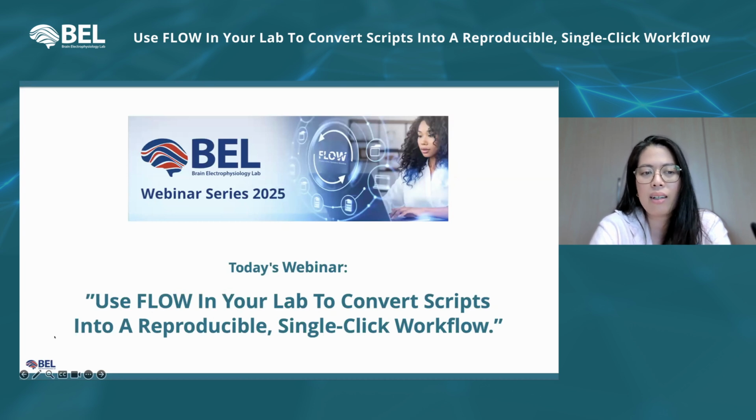We are still improving it, but hopefully soon we will publish some results with the pre-processing pipeline. Nowadays, this is the pipeline we're using in the laboratory. And continuing with what Roma said, we also developed this pipeline because of licensing aspects.